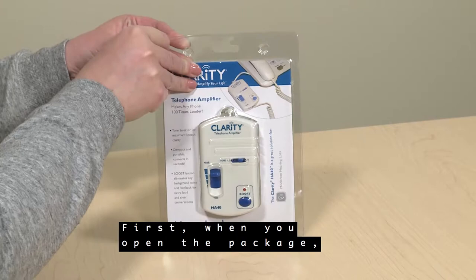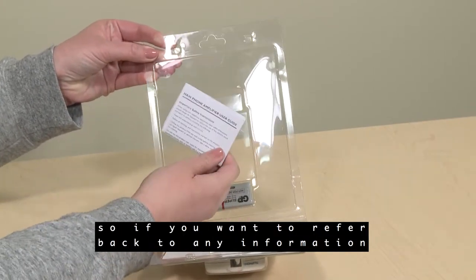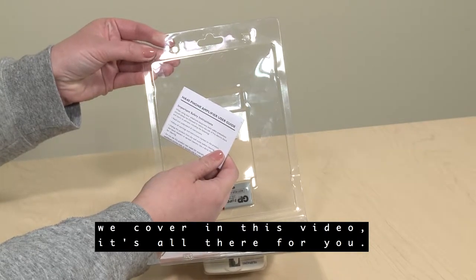First, when you open the package, you'll notice that the user guide is found with the unit, so if you want to refer back to any information we cover in this video, it's all there for you.